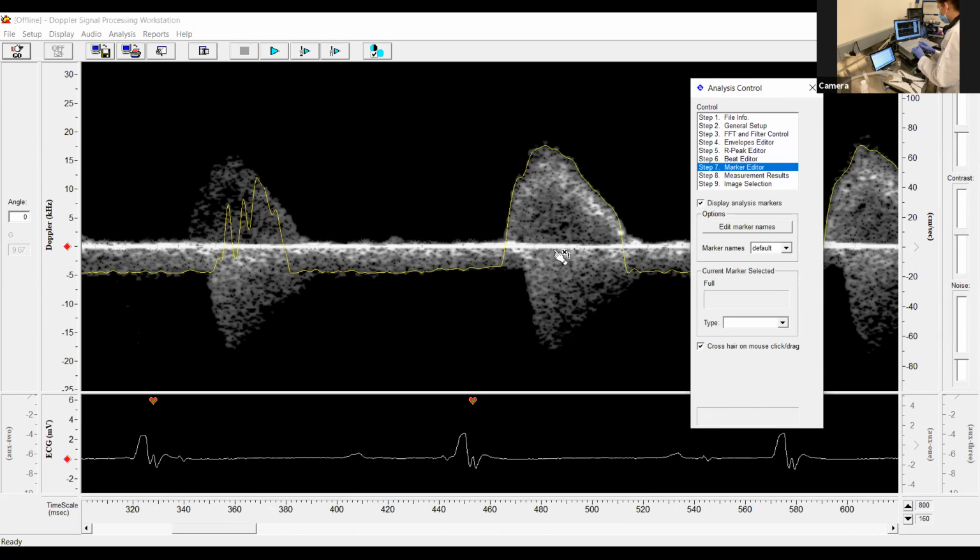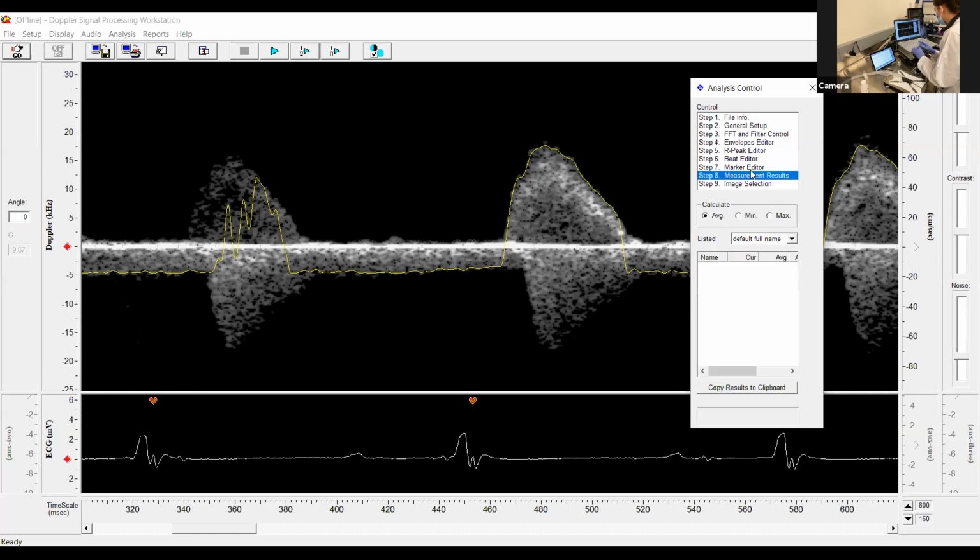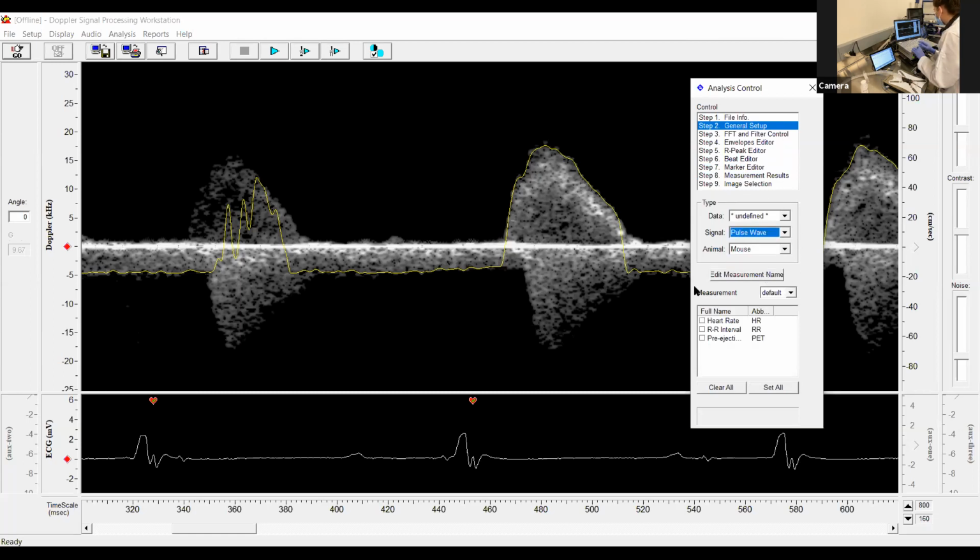I forgot how the measurement package worked. We'll send a follow-up with this, but it's really just a few nanoseconds. So I believe it's a calculation you have to do.